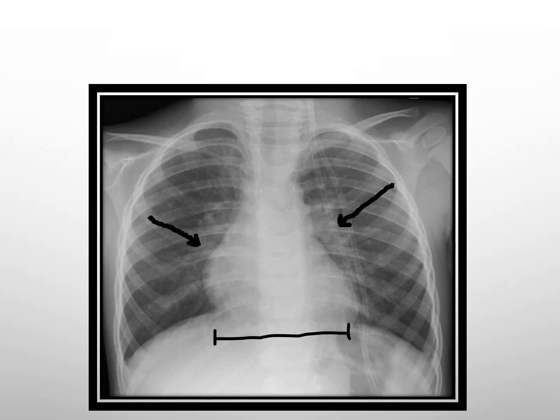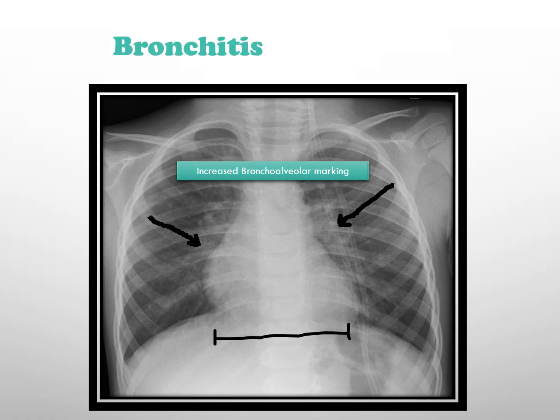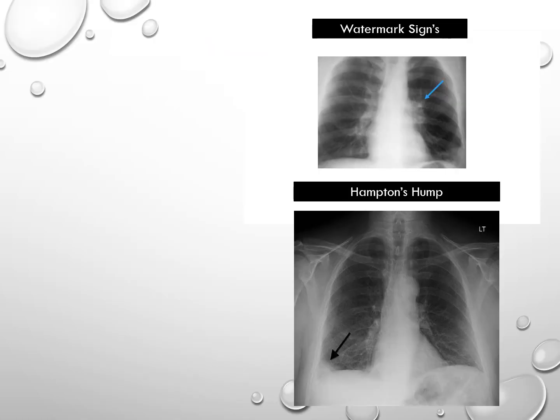This x-ray shows bronchitis. We can see here increased bronchovascular markings and increased cardiothoracic ratio.